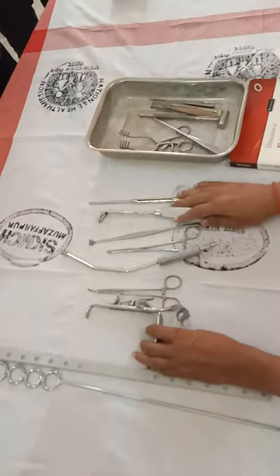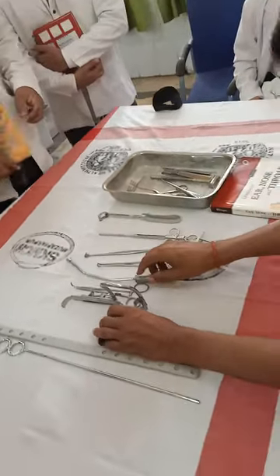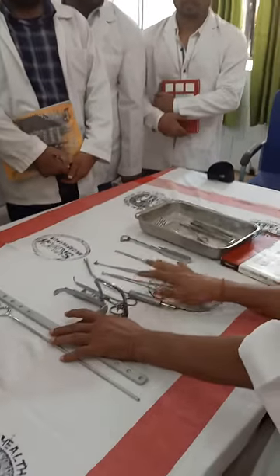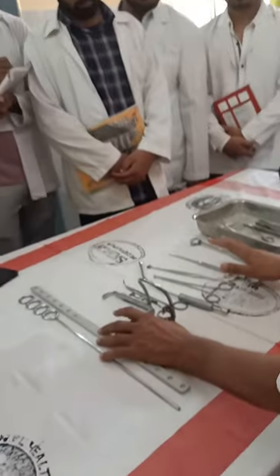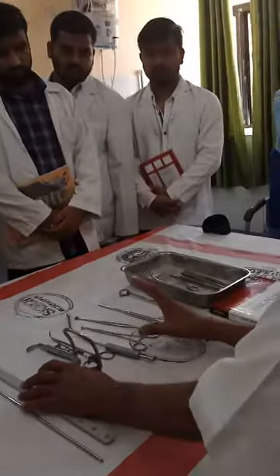This is the operation of the adenoid. This is the adenoid method. Everyone is aware of the adenoid anatomy and the admired method.